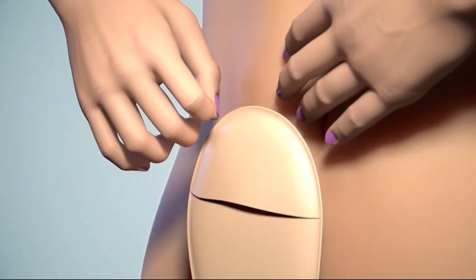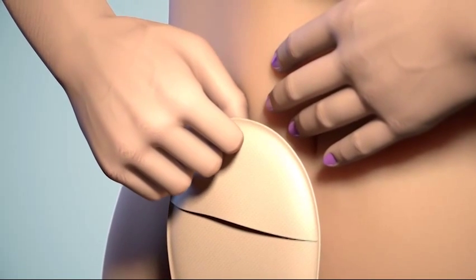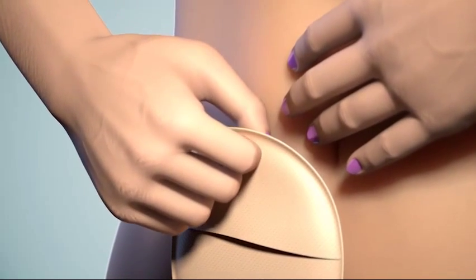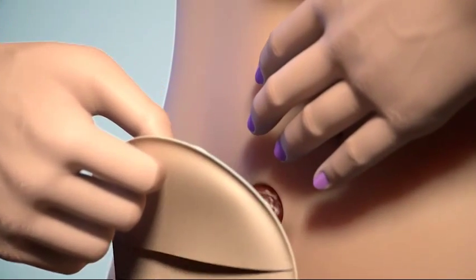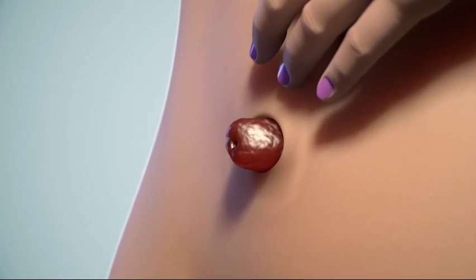Place one hand on your skin above the bag, and then with your other hand grip the top of the bag and flange. Then gently start pulling downwards away from your body to remove the bag, always remembering to support your skin whilst doing this.